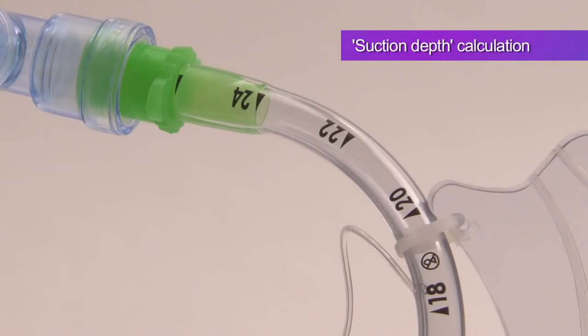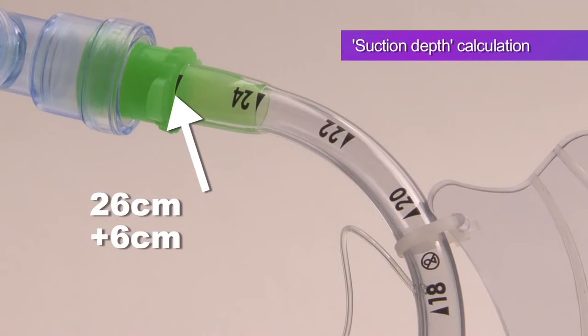Depth of catheter insertion can be calculated by using the number at the top end of the ET tube at its connection with the 15mm connector. In this case, the ET tube is 26cm long. Now add 6cm to this figure and you'll get a measured depth of 32cm.